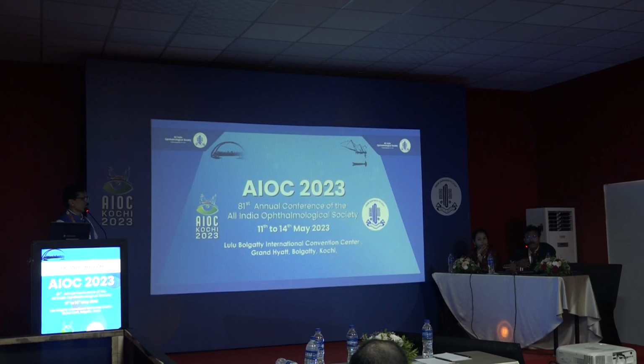And you do a little bit myopic. What is your suggestion? Pardon? Myopic. Yeah, always better to go myopic, and it depends on both eyes. When you do surgery, you do a little bit myopic, one diopter, that will be better tolerated. Hypermetropia is not well tolerated by the patient.